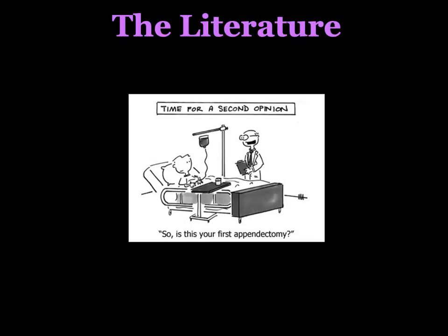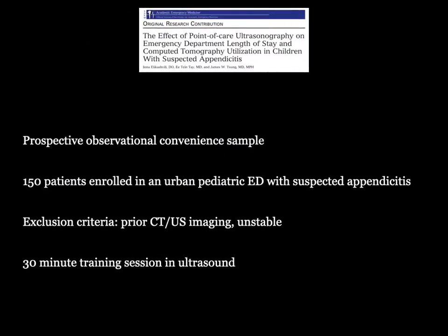So let's talk about the literature on using ultrasound to diagnose appendicitis. Most of the literature looking at the use of POCUS, or point of care ultrasound, in appendicitis has been published in the pediatric literature. This is a really nice study that was published in Academic Emergency Medicine in 2014 by a group of pediatric emergency physicians in New York City.